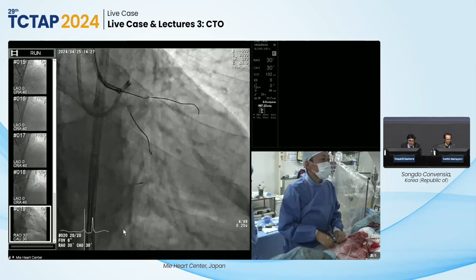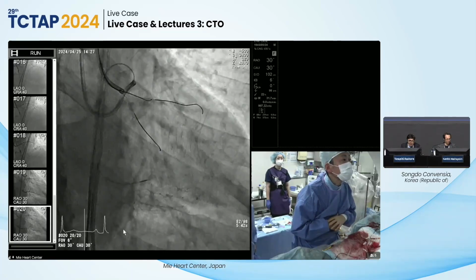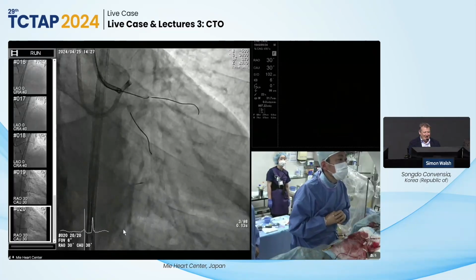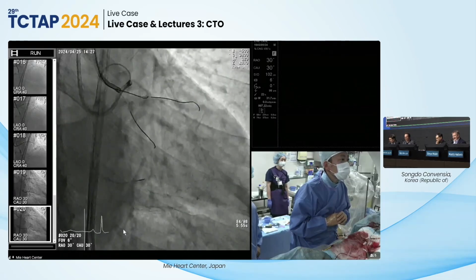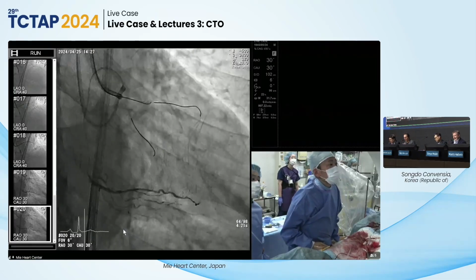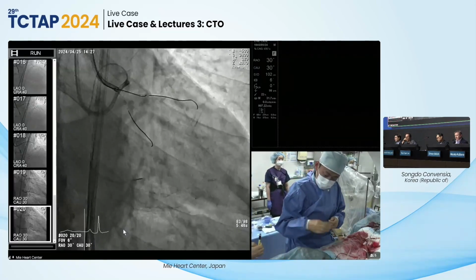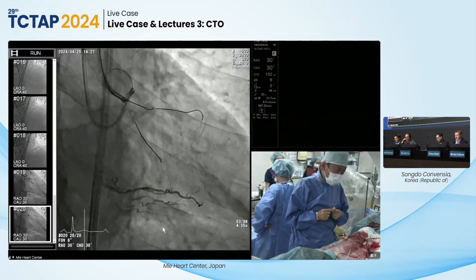So there is some collateral. Yeah. Okay, we can try. What the rest of the panel see, but it always seems to be that they come off the apex of the bend. Yeah, there are some proximal ones coming up from the side branch, but what we don't see at the moment here, Kinja, is the uptake angle. So how are they really going into the septal? So sometimes it's not so easy to get that wired at the proximal. So the proximal part of those, or the first entry point. So we'll see how that works.